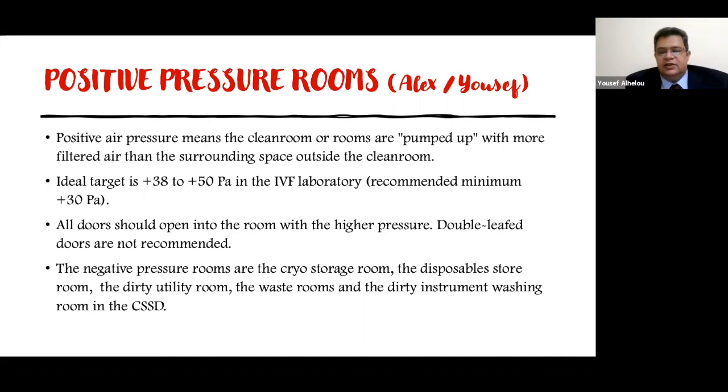Yes. I think most IVF labs are connected to the operation theaters, and once you open the door for ovum pickup or embryo transfer, the differential pressure will go low.